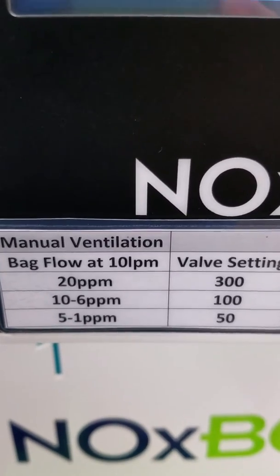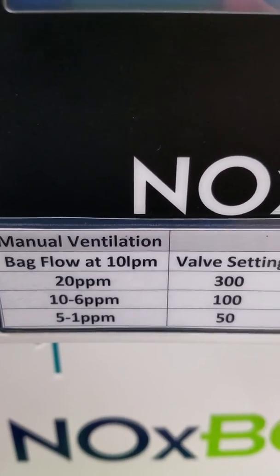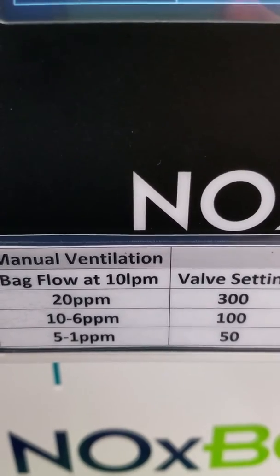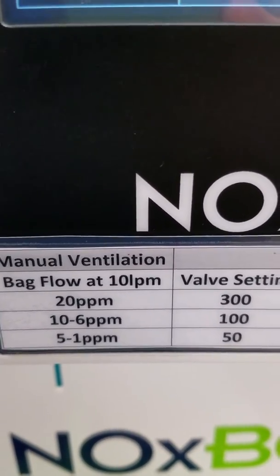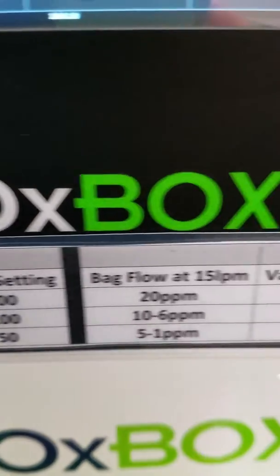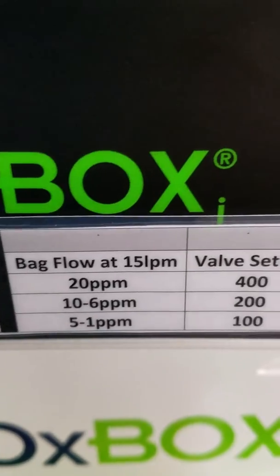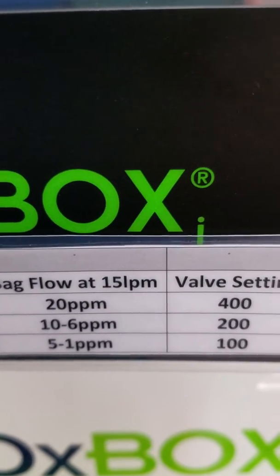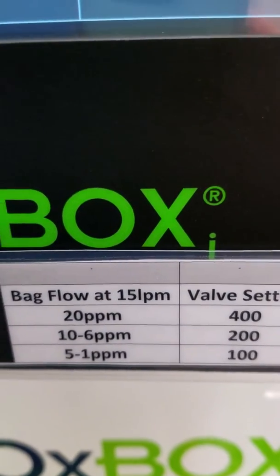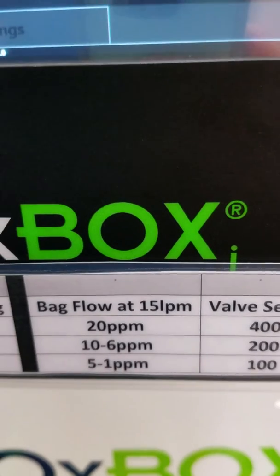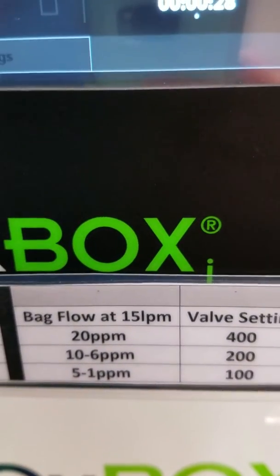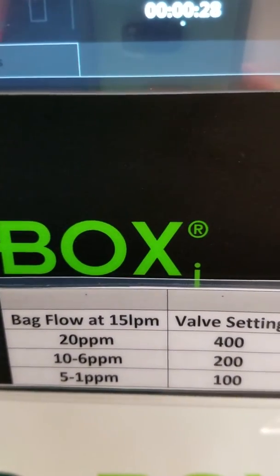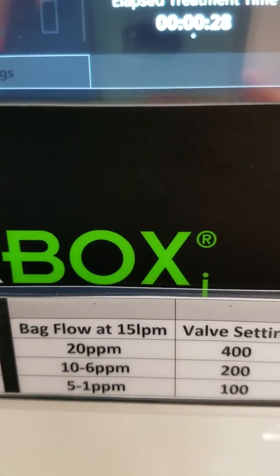For 10 to 6 parts per million, I'll set the valve at 100. And for 5 to 1 parts per million, I'll set the valve setting at 50. I also have similar settings for a bag flow rate set at 15. This is an easy reference to place on the front of the machine so that we know how many parts per million and what flow rate we'll need to bag to get the dose required.